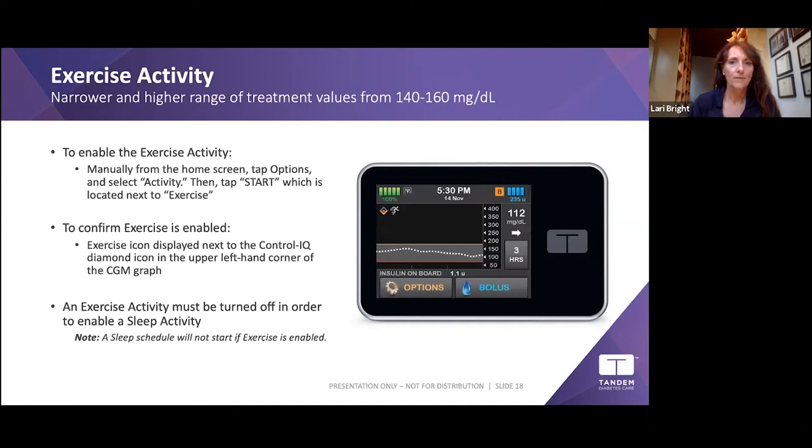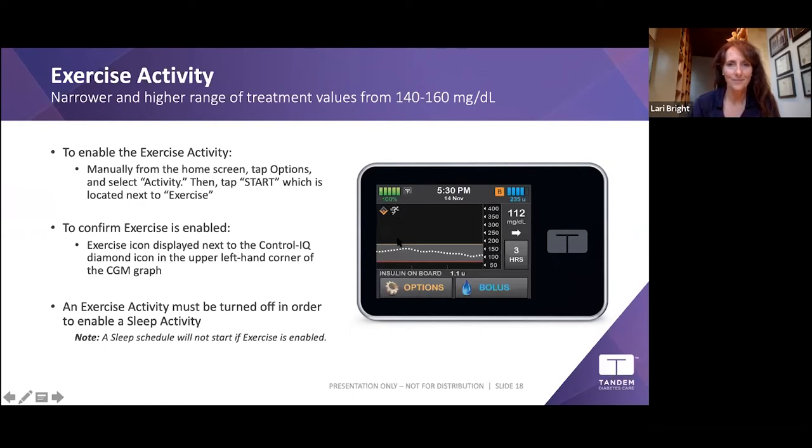Here's what the running icon looks like on the pump screen when Exercise Activity is turned on. Settings are the foundation of Control-IQ — your basal rate, correction factor, and carb ratio are all critically important. You teach the pump about you; the pump doesn't learn you. These settings are important for you and your doctor to adjust at your appointments.